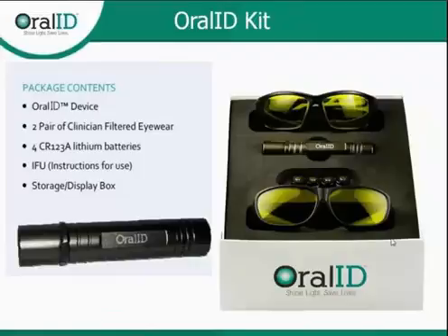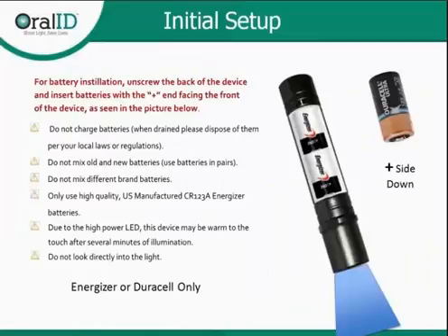The glasses are a filtration system, so it's not protection. It's not like your UV or your curing light. Your patients do not have to wear these glasses. The reason there's 2 pairs is if 2 clinicians want to look at the same time. So maybe the hygienist sees something suspicious. She wants the doctor to come and reevaluate what he or she found. And so you guys can both look at the same time. That's the benefit of having 2 pairs of glasses. It's not necessary for the patient to wear them.